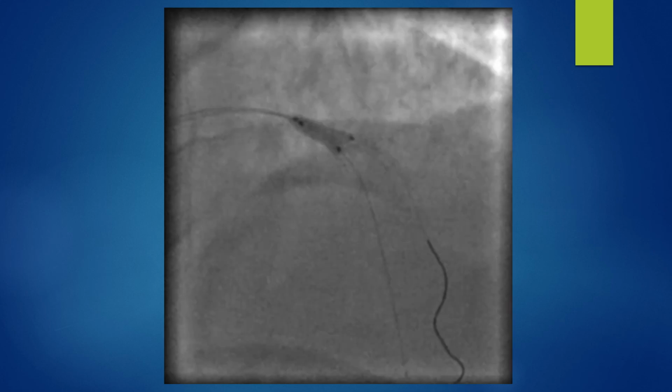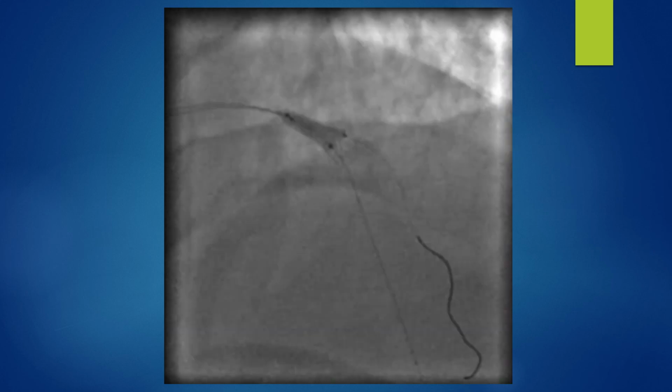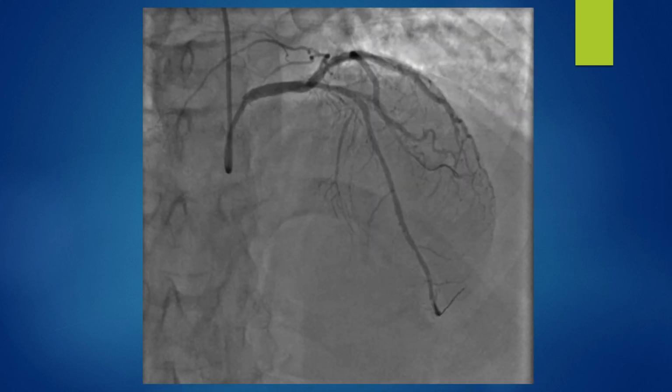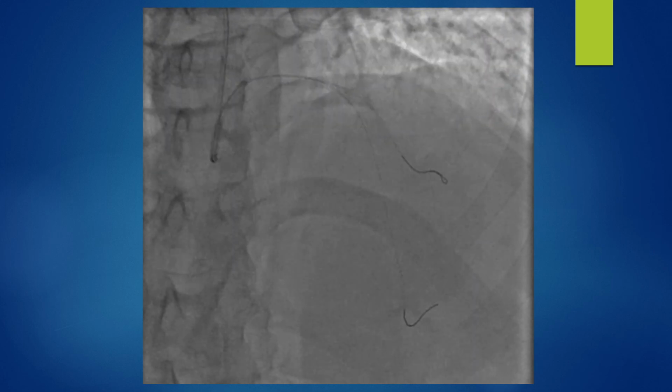And then I performed kissing balloon angioplasty using a 2.25 by 12 millimeter balloon in the diagonal branch and a 2.5 by 10 millimeter balloon in the LAD branch. And this is the final angiogram, which shows excellent results.